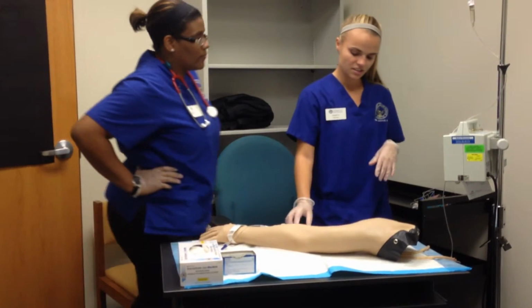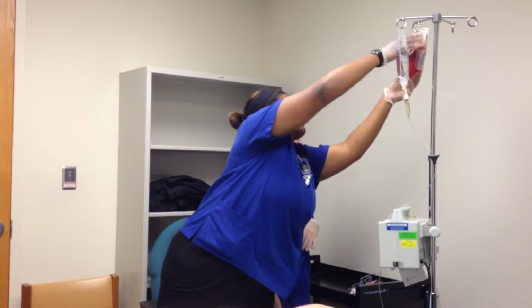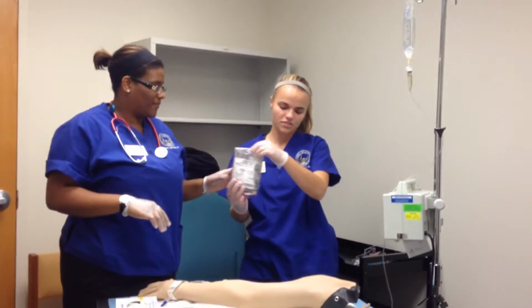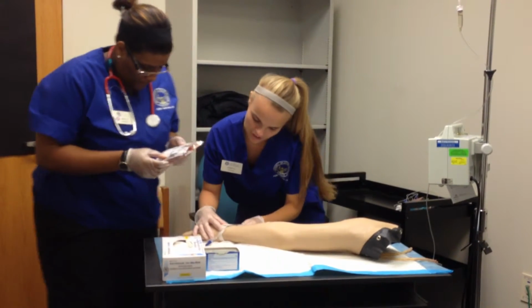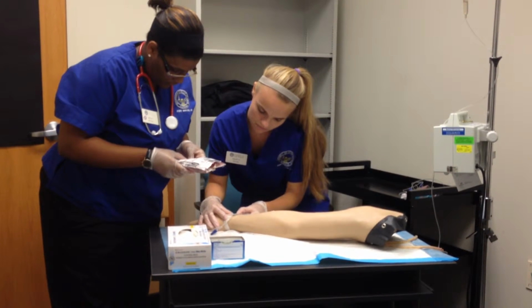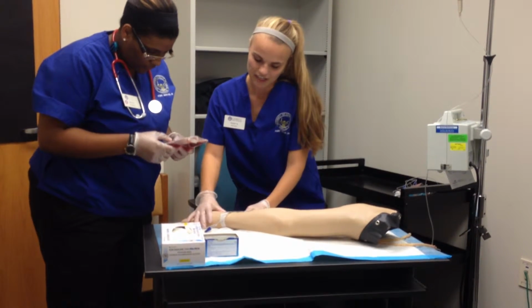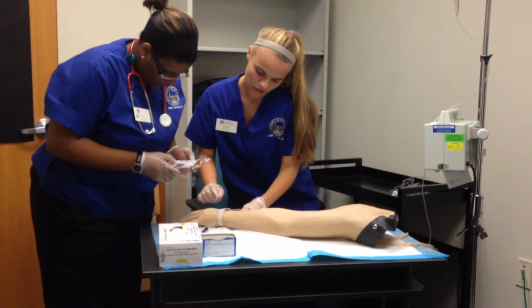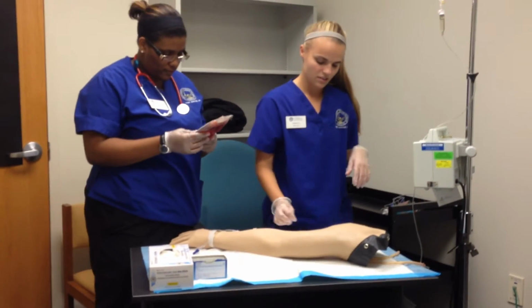Alright, and I got your blood. I can reach it. I'm short. Here, I got it. Just need to check it with your bands here. What's your number? 38FH66683. Can you tell me your name and your date of birth? Alright, that's good. RH positive, and you're O positive, so that's good. Expiration's 11/10 of this year, which is good. Alright.